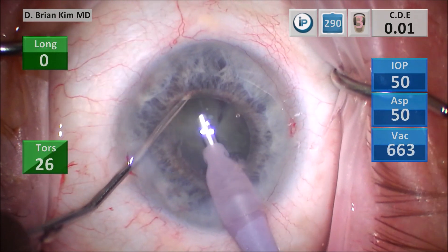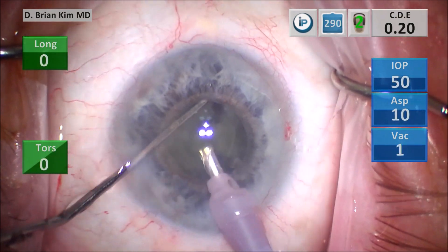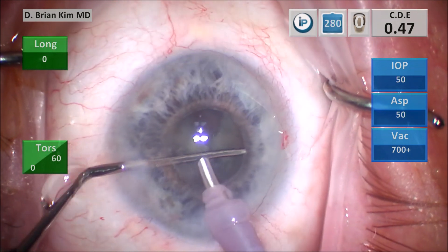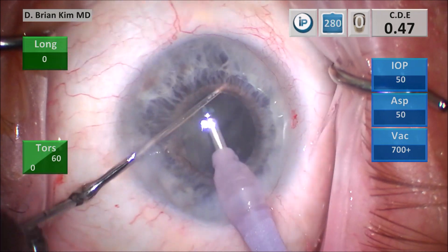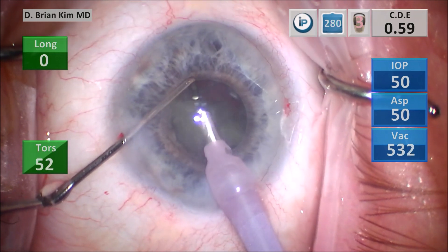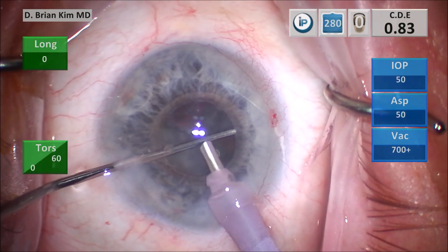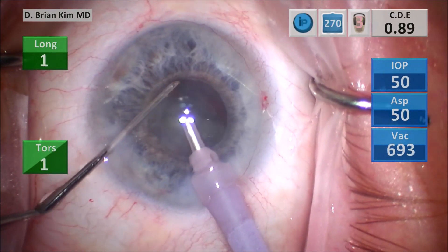I lift the first quadrant using high vacuum, pulling it up out of the bag, then placing the chopper around the lens, crushing the lens into smaller pieces, and then emulsifying. Place the chopper around the second quadrant, crushing it against the phaco tip, pulling up the lens piece with high vacuum, and then emulsifying the lens pieces. There's a little bit of remnant of that second quadrant. I'm placing the chopper out to the equator, pulling that lens piece up, and then using high vacuum to remove the lens pieces.